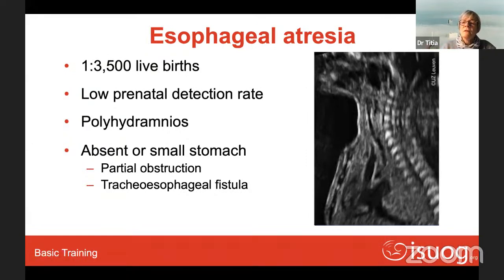So the moment the baby swallows and you are so lucky to see it and you have the optimal insonation of the esophagus, you might be able to see the fluid going down to the stomach, but that is so rare. It's so difficult to catch. There are some very nice images on the website where you can find this, but I tried for ages to get this measurement. I have it once somewhere, but it is difficult.